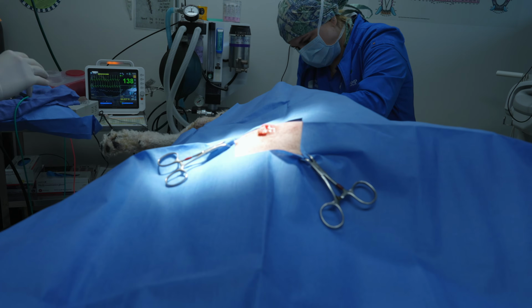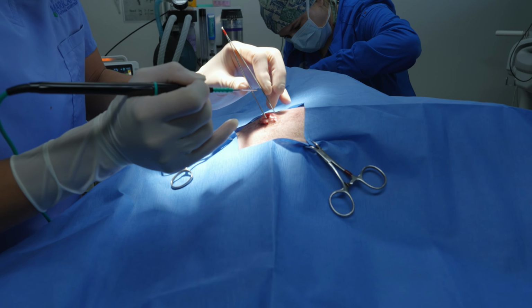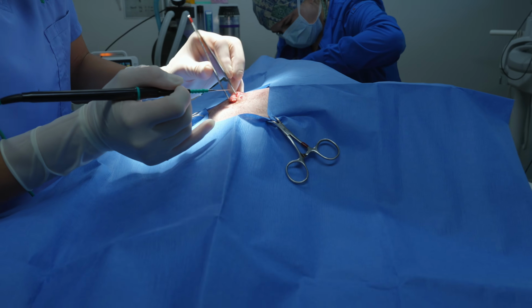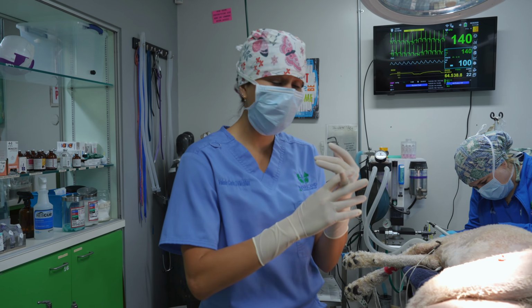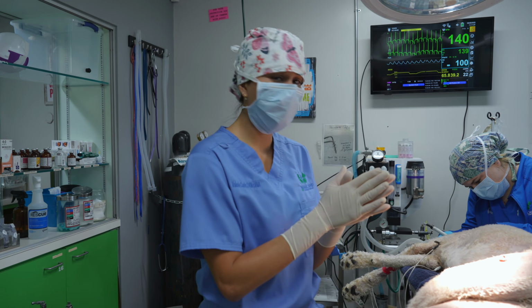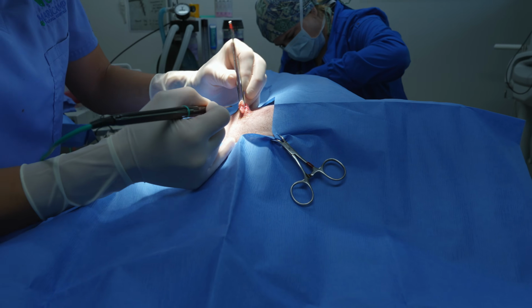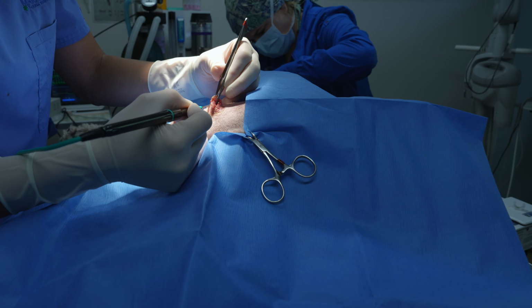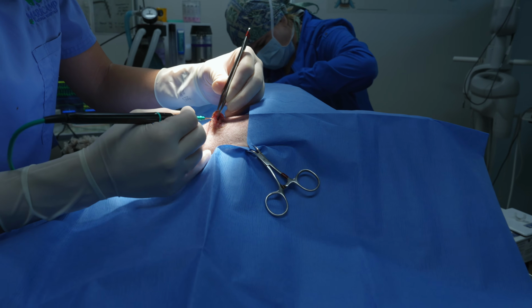I'm going to remove these growths that are ruptured and are just being very annoying for the patient. It is very itchy, it is very painful. We did everything necessary, we did blood work, the patient is healthy, so therefore we're just going into surgery to remove those growths. Send them out for histopath to see what they actually are and to see if we need to change our treatment plan. But the best thing to do for them is just get them out of the body. So that's what we're going to do today.